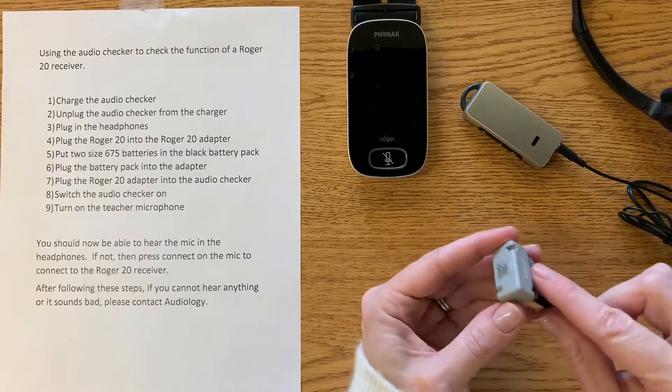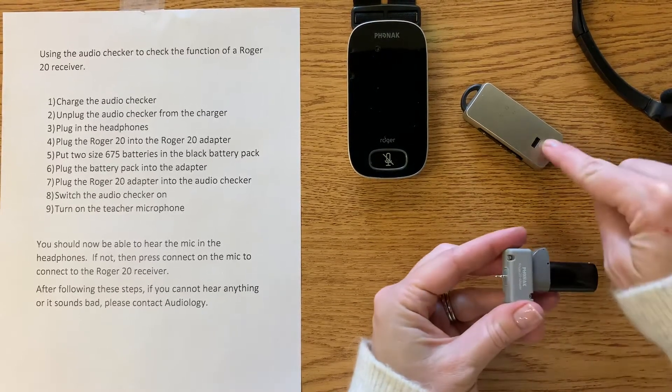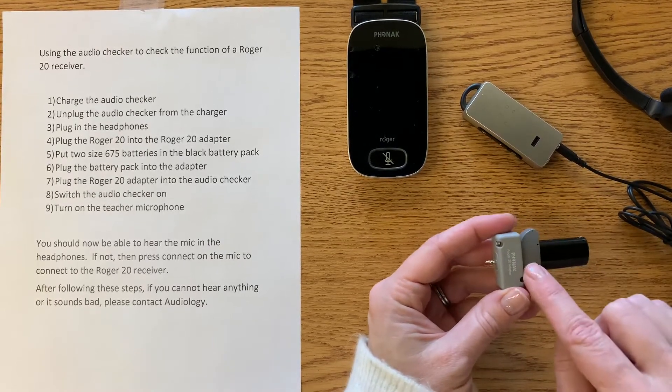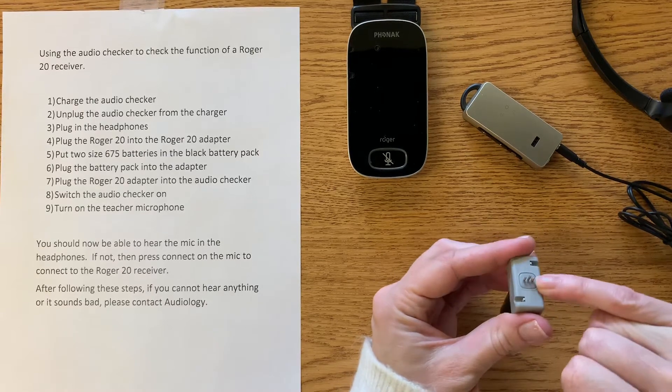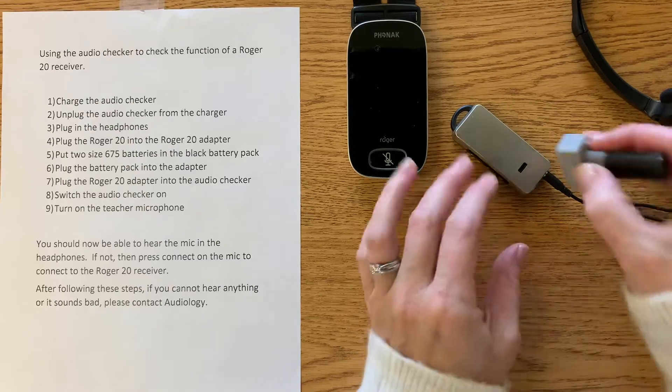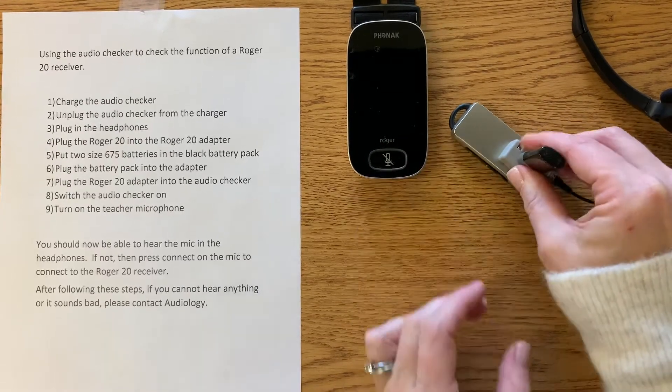Next, we need to plug this into the checker. This is basically simulating a cochlear implant just to be able to check that Roger 20 receiver. So we're going to line up that bigger post with the bigger hole on the checker, and it should fit in snugly.